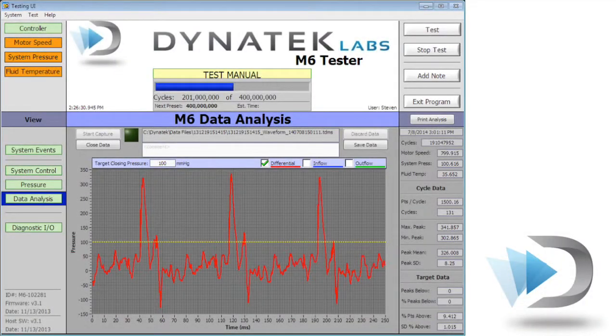Up to 12 pressure transducers can be simultaneously calibrated and closing pressure parameters are readily calculated. From here, it is easy to attain 95% of cycles reaching the targeted closing pressure for 5% of the cycle time.